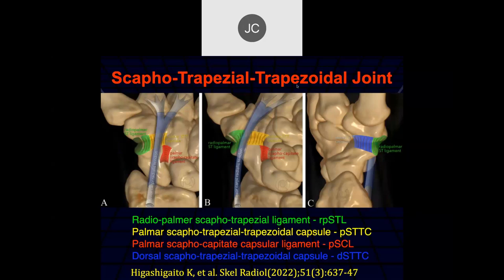There is a complicated scapho-trapezio-trapezoidal joint with different ligaments stabilizing it. I rarely call out these ligaments specifically in imaging, but if the surgeon is concerned about specific parts of the capsule, I would look these up and compare to the images.